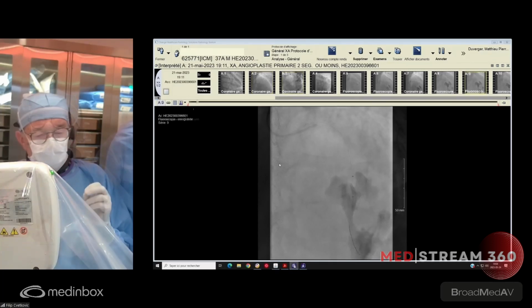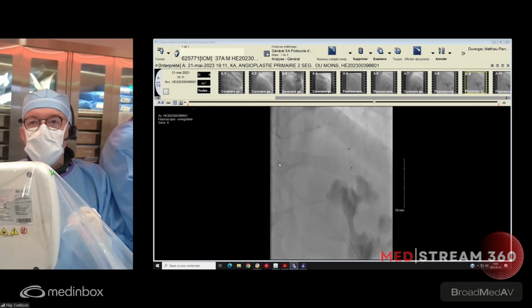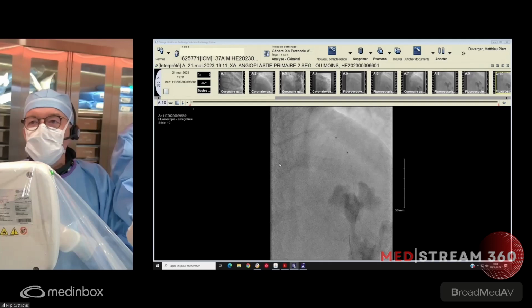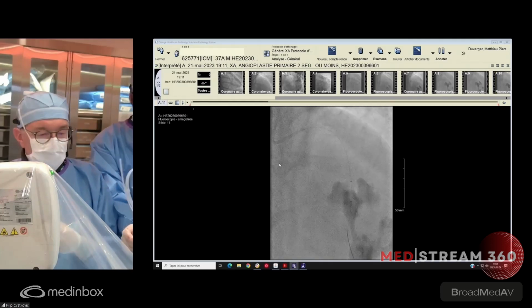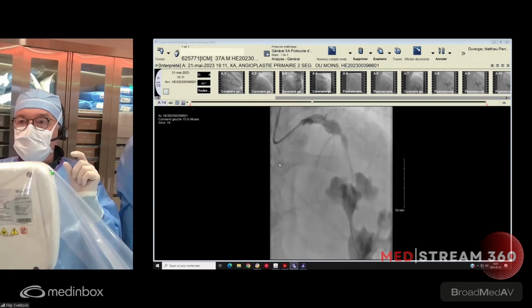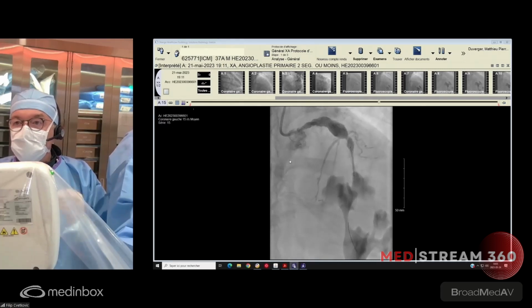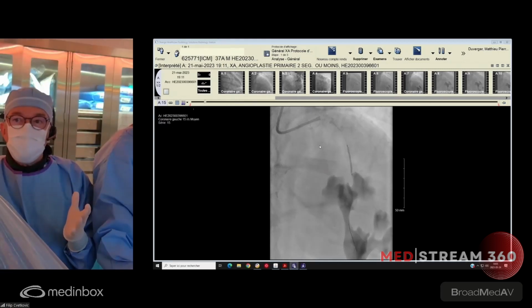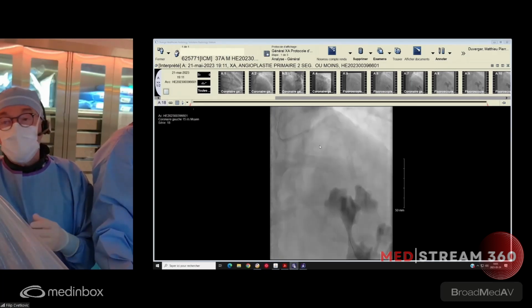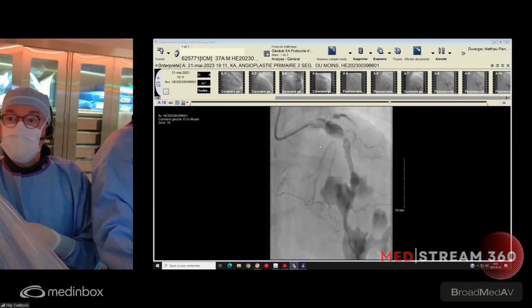aneurysm formation. Because of the occlusion, the aneurysm, and the thrombus, it was decided to use thrombectomy selectively to better evaluate the dimension angiographically and try to establish flow. You can see that there's reestablishment of flow. It's not normal. You can see past the aneurysm, the lesion, and probably an ulceration. Let's do a stent, obviously, to open that vessel, because plain balloon angioplasty in Kawasaki, we suspected, there was no history, but of a Kawasaki disorder in the past.